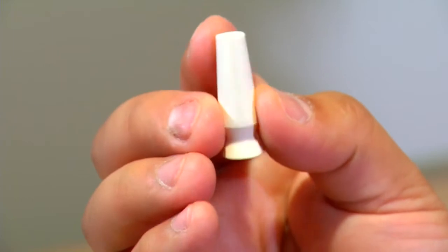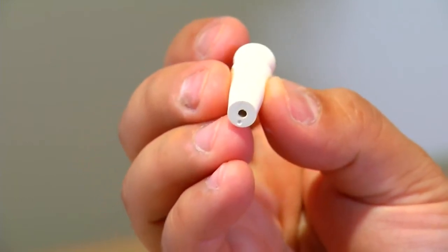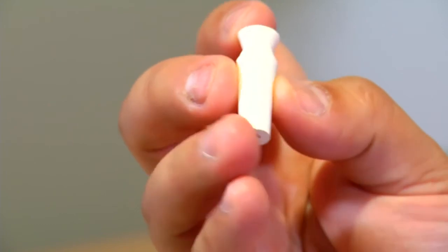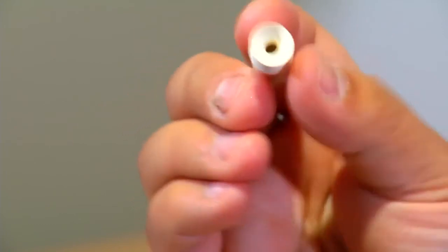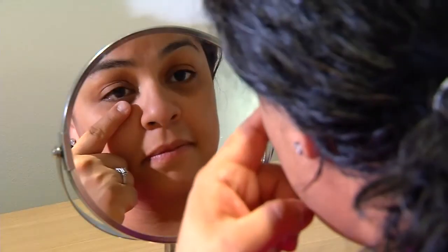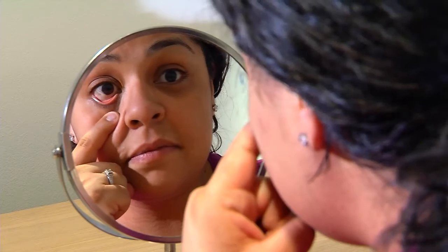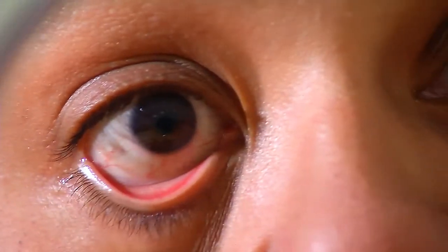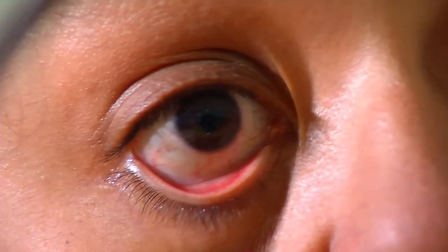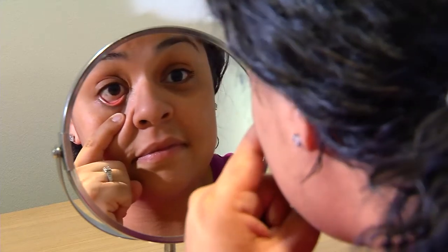A suction cup with one end cut off, or one that has a hole running all the way through it, can also be used. With drilled suction cups, it's critical that they're squeezed tightly when applying the lens to create the suction. Once the lens is in place, use a mirror to look for bubbles that may be trapped under the lens. Bubbles can blur your vision, so if they're present, remove the lens, refill the bowl of the lens with the recommended solution, and repeat the steps for application.